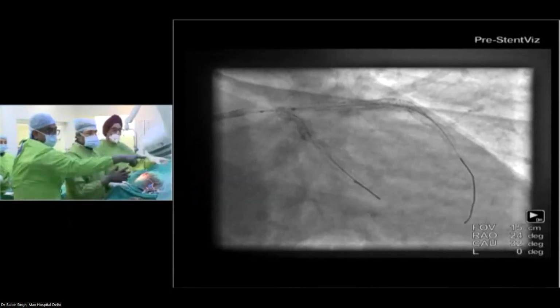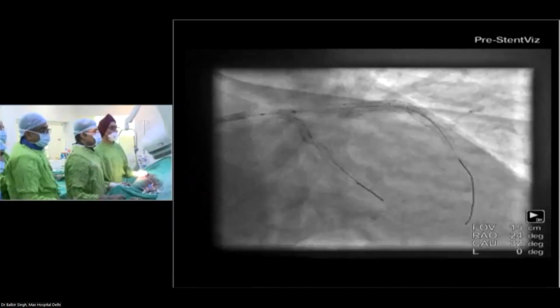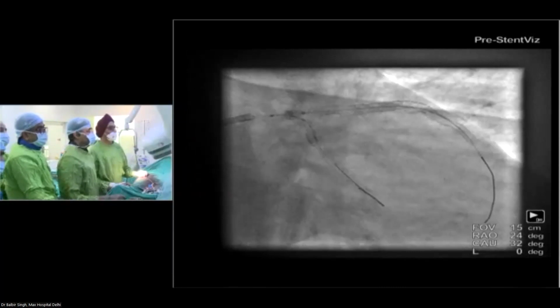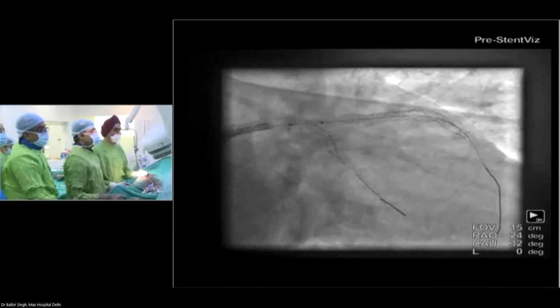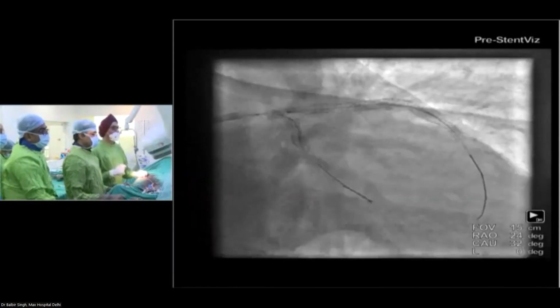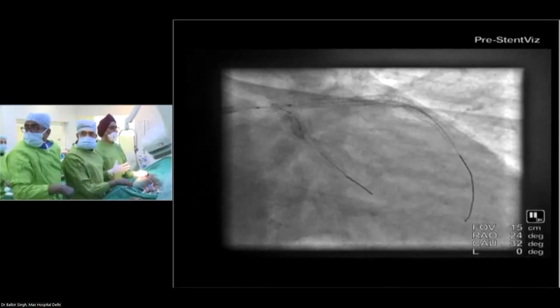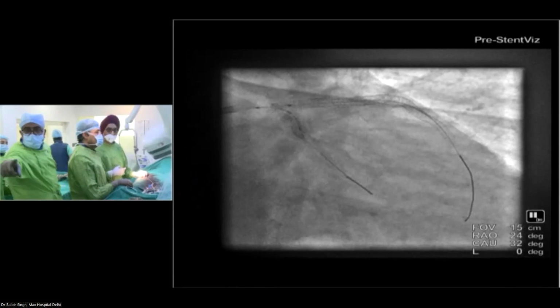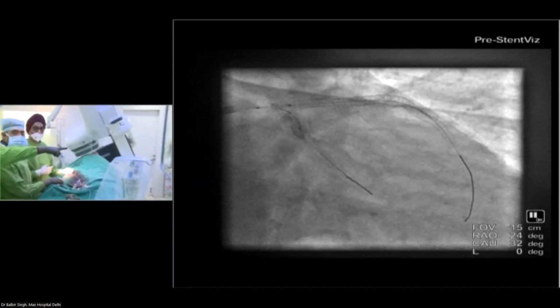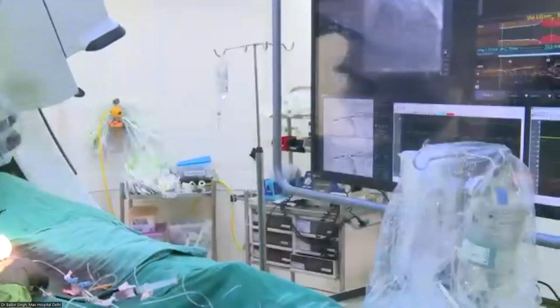So we see you had probably achieved some kind of stent shortening in the left main. The stent was deformed while we were struggling to get the balloons into the circumflex, and that was preventing us from getting the balloon. Even though we were anchored, the wire was through the proximal struts, everything was correct. This is a very good case to show that sometimes with anchoring you could provoke such shortening because the guiding catheter is coming in. He was quite aggressive with the guide too. Yeah, banging on it, that's correct.